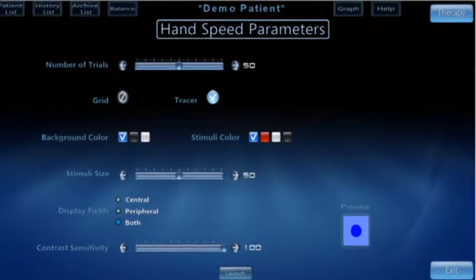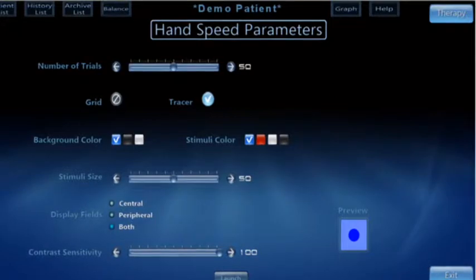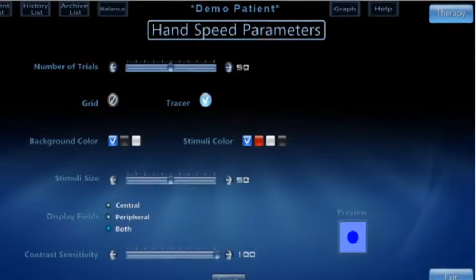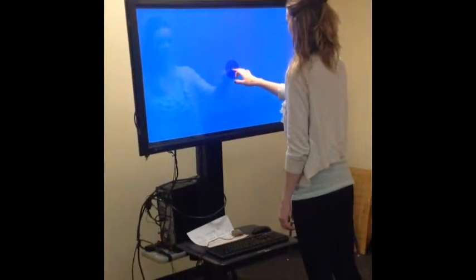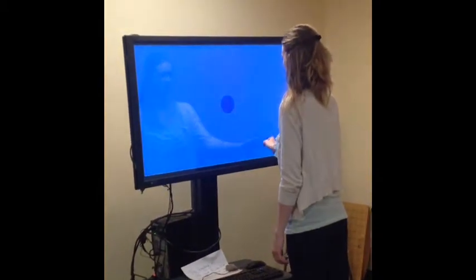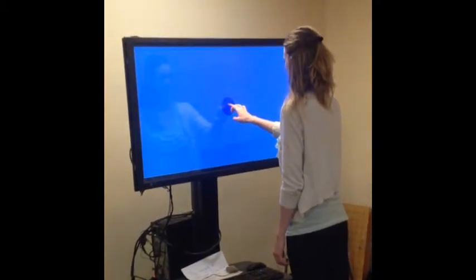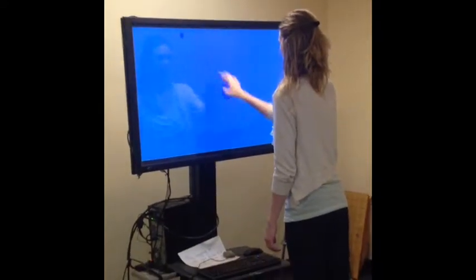Here are the parameters for Hand Speed. They are similar to the Proactive and Reactive programs, without as many options. In the Hand Speed section, the patient has to touch their finger to the middle circle and then press the stimuli as fast as they can as they appear.